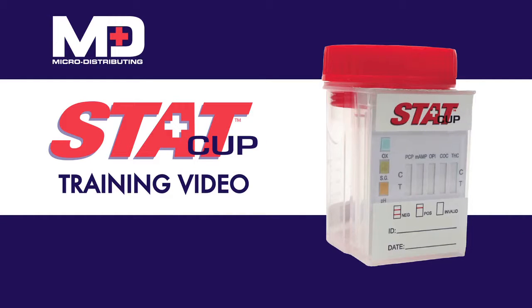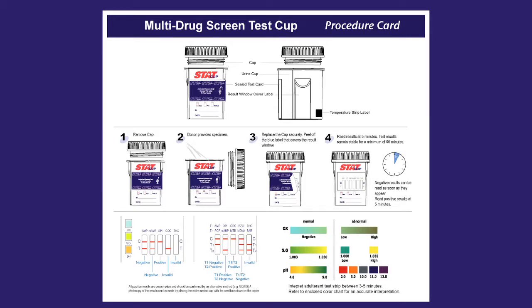StatCup is an easy-to-use, fully integrated on-site urine drug testing device. New and innovative, StatCup provides quick and accurate results. In this video, you will learn and observe the advantages of the StatCup, how to store and administer the test, how to interpret test results, how to document test results, and what to do when confirmation is needed for preliminary positive test results.